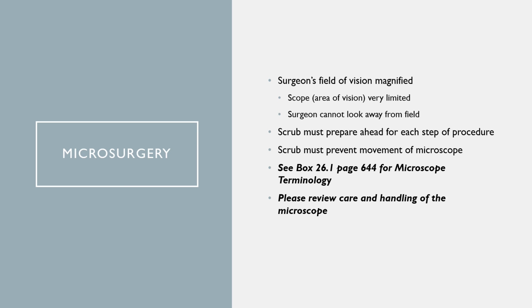The ST needs to pay, as I said, close attention to the case. You may be viewing that surgical site through the microscope, so you need to make sure that you are taking extra care not to move or bump the microscope during that procedure. We do not want to cause this patient an injury or cause the surgeon to lose any kind of concentration. So it is imperative that we have a steady hand, not to make you guys nervous, but it is important.